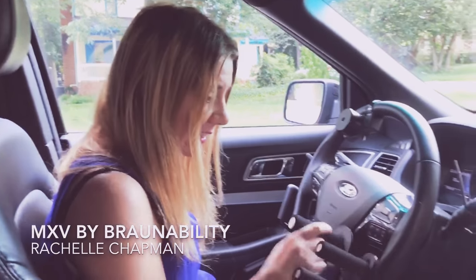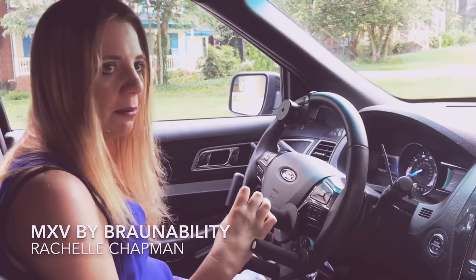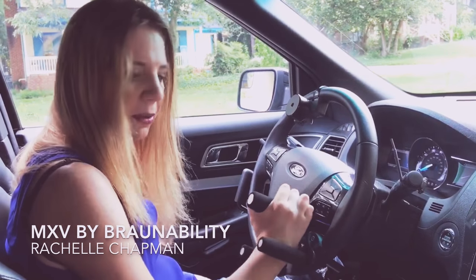This is the first thing that is really important for quads. Since I can't grip the steering wheel, I need some way to grab onto the wheel. So what I do is I slip my hand into here, and then I'm able to maneuver the wheel.